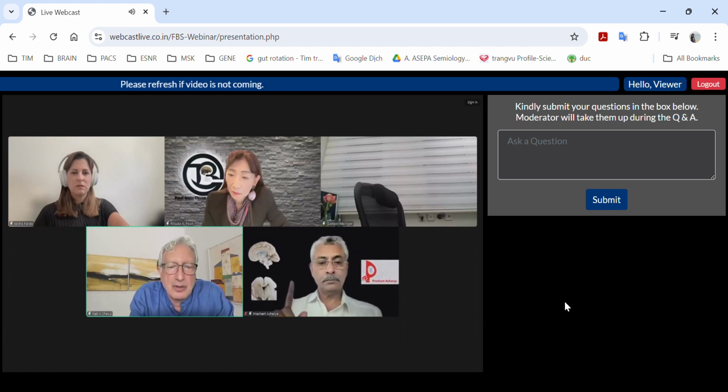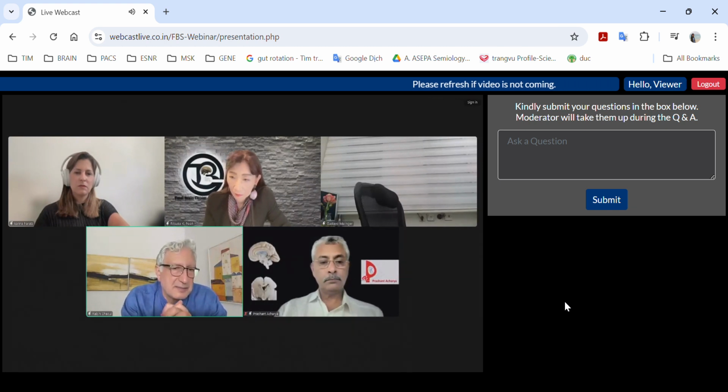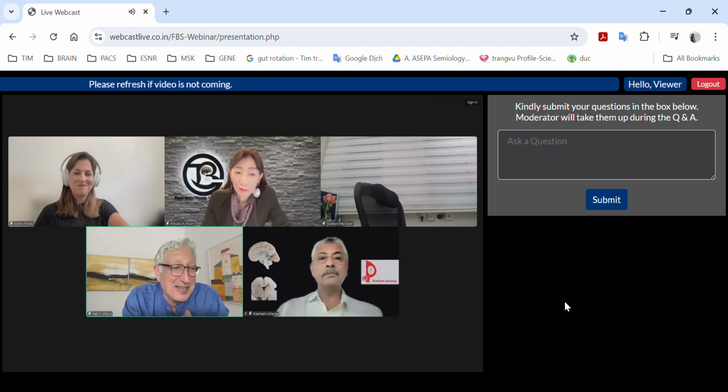But if you add to your checklist the Sylvian fissure, the shape of the CSP and the asymmetry of the brain, the anterior to posterior comparison, then you may discover these things. This is my comment. And for you, Nina, you give me now an idea for a new talk. We could call it one day, the face predicts the brain, not only on holoprosencephaly.